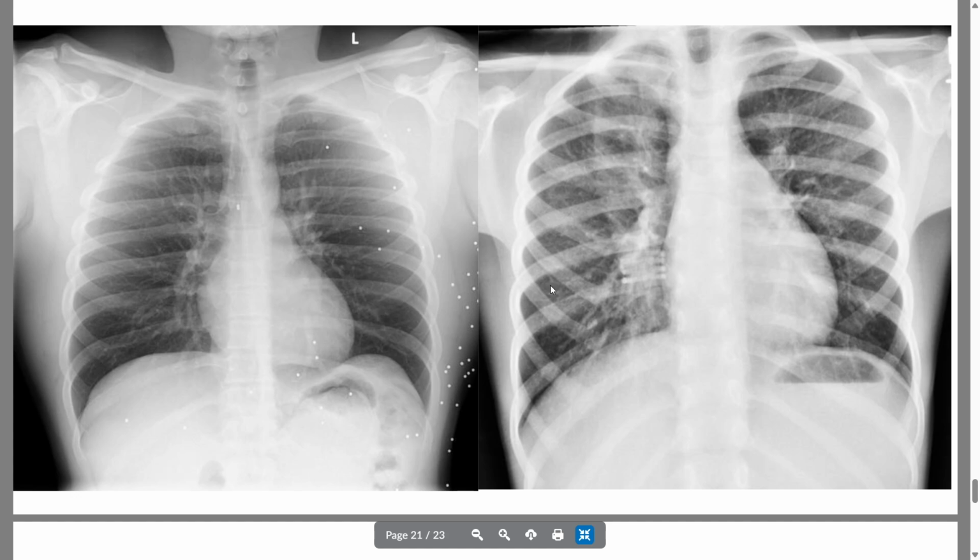On this patient, at first glance, you can't really see much. They have a nice mediastinal shadow. Lungs look a little less radiolucent, but nothing really of note until we get right here. And if you compare side to side, it's a bit more radiopaque on this side. And as we go down toward that left side of the heart, we see this artifact.